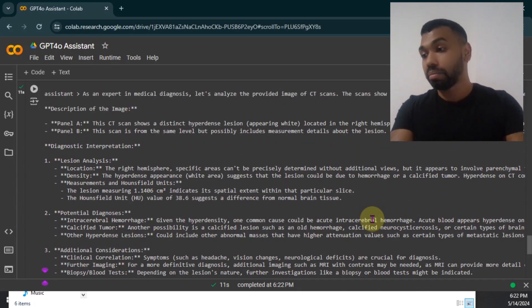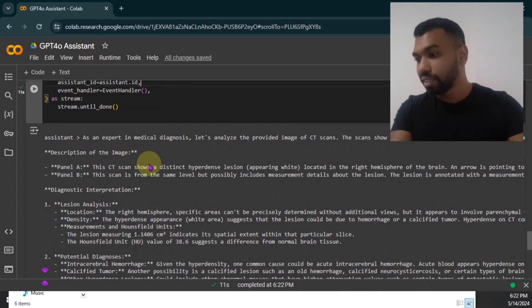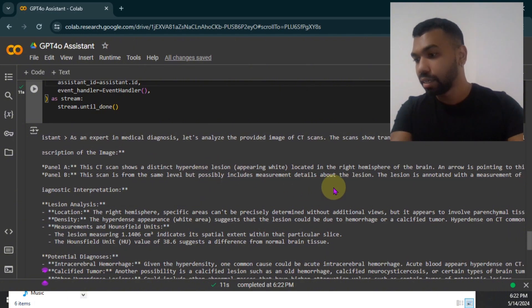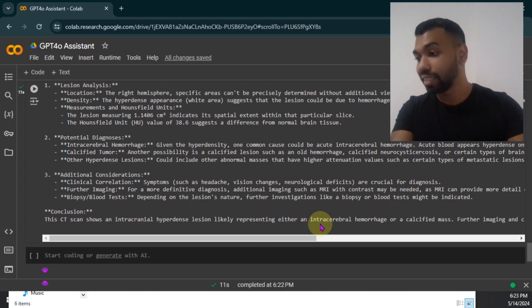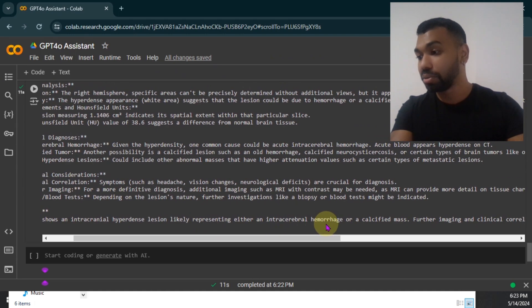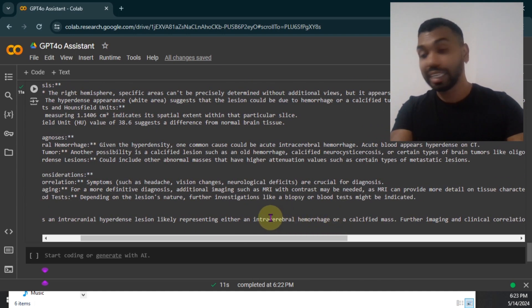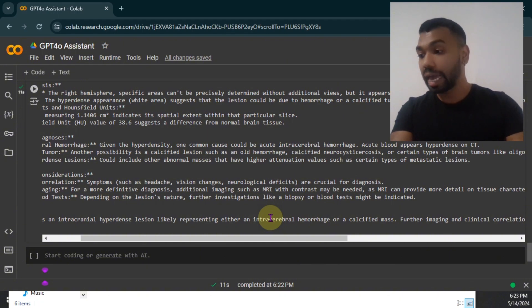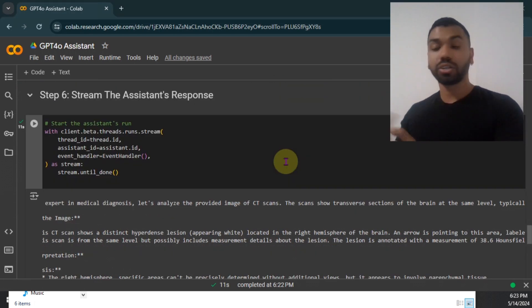The CT scan shows a distinct hyperdense lesion appearing white. Conclusion, this CT scan shows an intracranial hyperdense lesion likely representing an intracerebral hemorrhage. I can't even pronounce these words, but check this out. It successfully detected a hemorrhage. I did not provide any kind of message other than the image itself. So this is great.